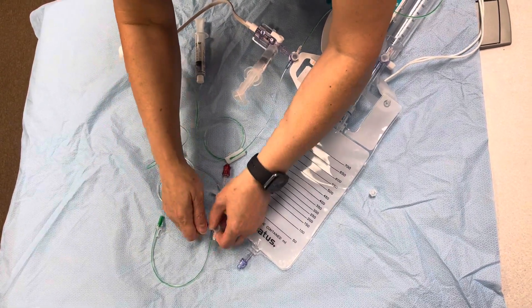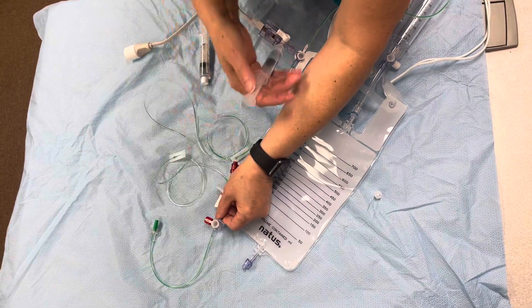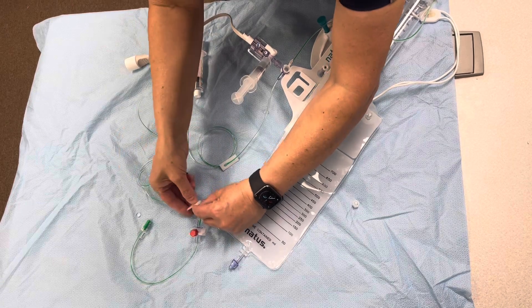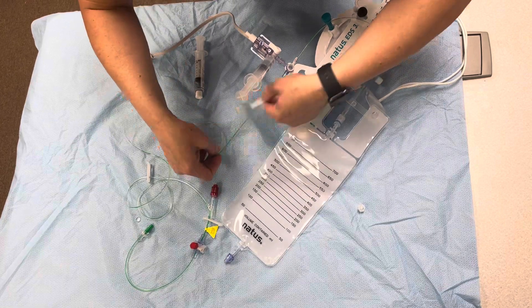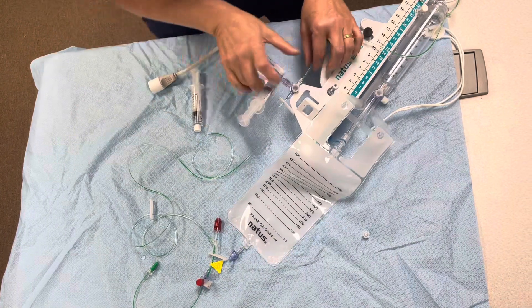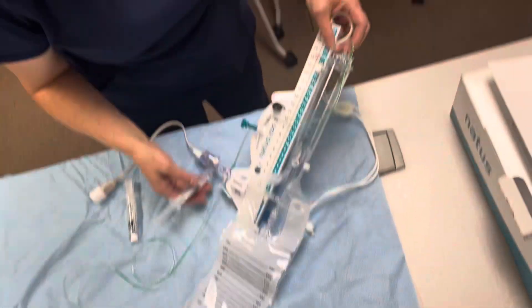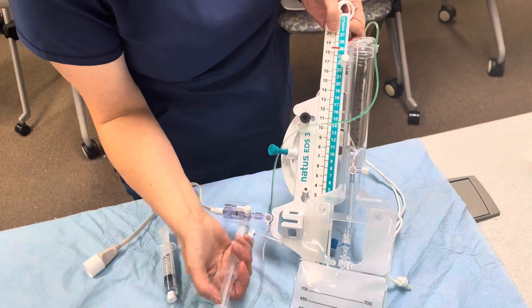Close the red cap, close off, and now you don't need to open that green hub. Now we have primed this piece as well. I can clamp, clamp so I don't lose my prime, and clamp closer here. I'm going to close off the three-way stopcock towards the patient. Now I'm going to prime the piece towards the drain bag — just watch the saline trickling into it.